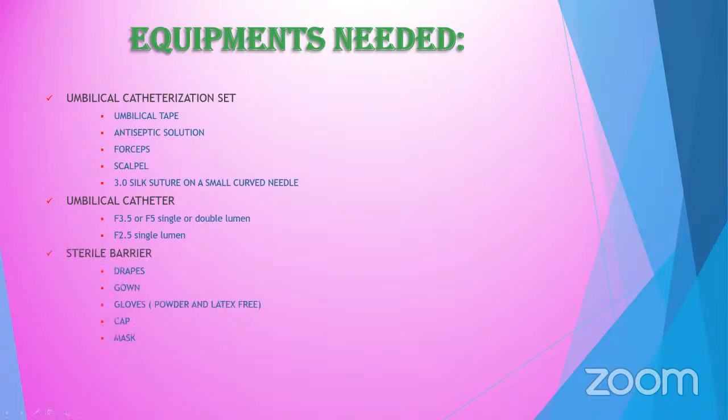Later, there is a workshop under Dr. Yahiya where we will show all the equipment needed. So we have umbilical tape and antiseptic solution. We are not using betadine anymore, only an alcohol swab, or the swab we use for blood culture. We can use that one.